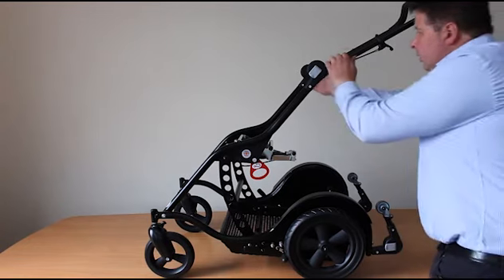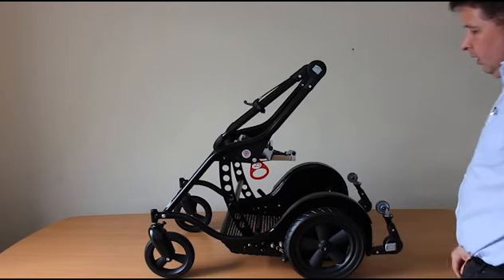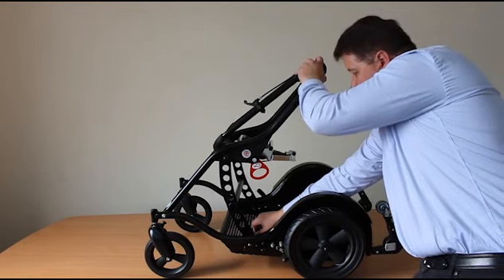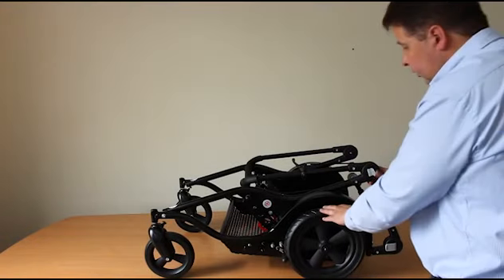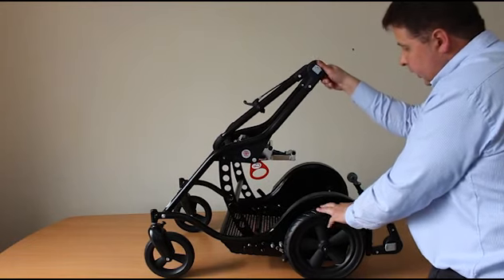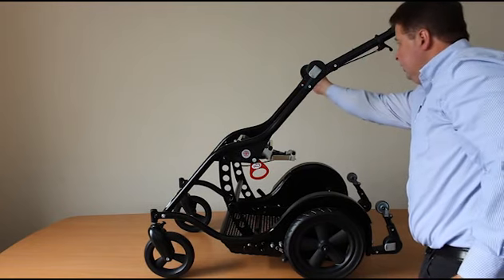To fold the frame, firstly undo the latches on either side and rotate the handle frame over. Then squeeze these two pins together and the frame folds down. To unfold the frame, lift the handle up a little, locate it into place, move the handle frame back to the desired position, and close the latch on both sides.